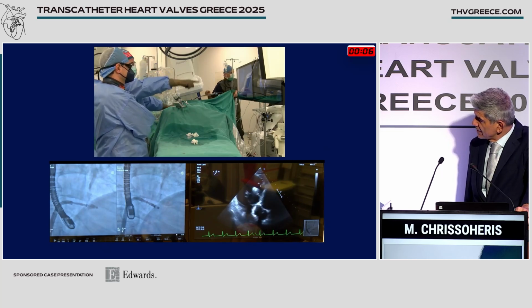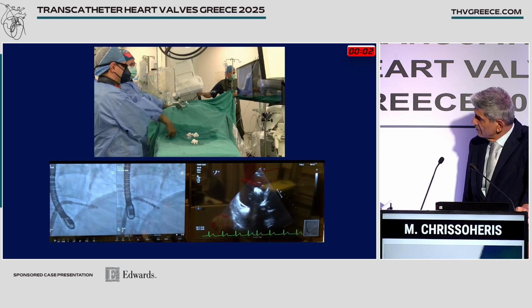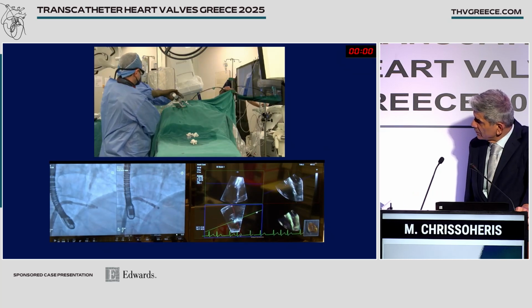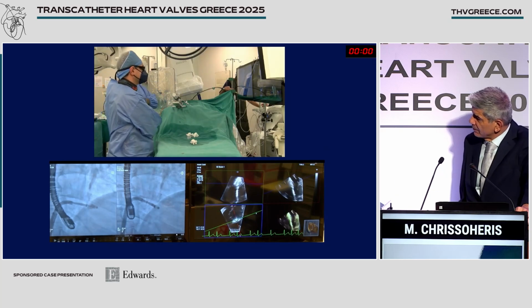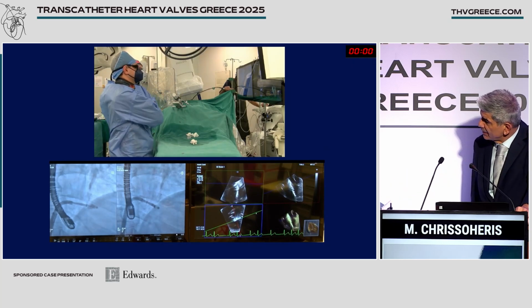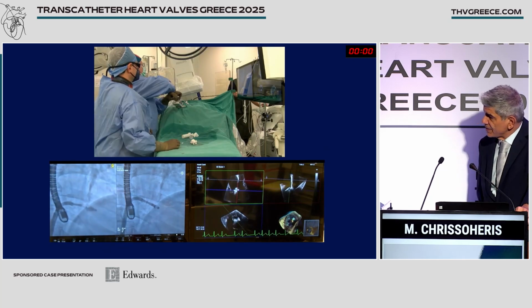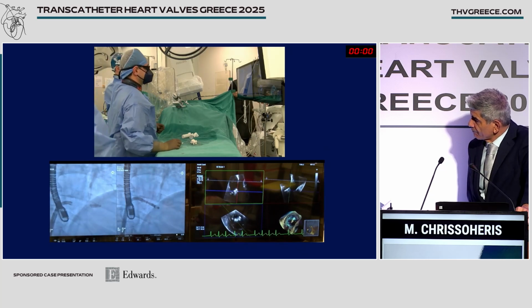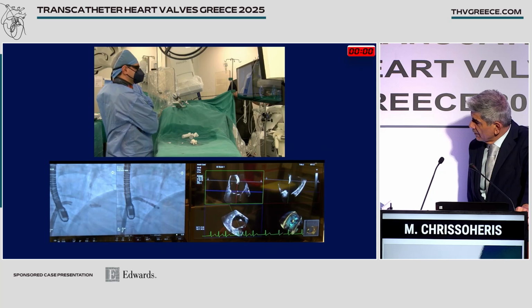Again, our position is septal posterior near the center of the valve. We assess the leaflet insertion with multiplanar reconstruction. Sometimes it's not always easy to see. So with MPR, we confirmed that we have enough septal leaflet inside and lateral leaflet as well. And with this, we went ahead to deploy this device as a first device in the center to septal posterior area of the valve.